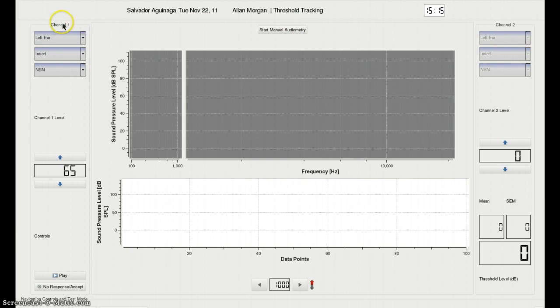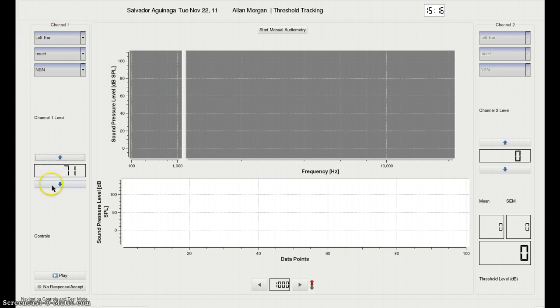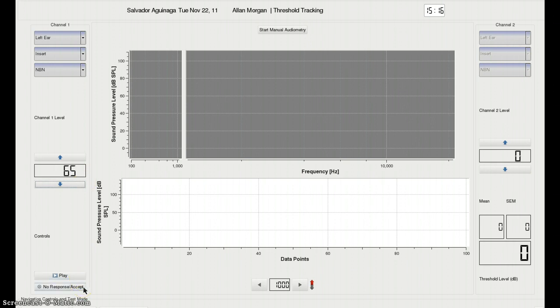We still have Channel 1 and Channel 2 controls, although only Channel 1 is enabled at the moment. You can still change the level on the SPL output. Standard play and no response controls.